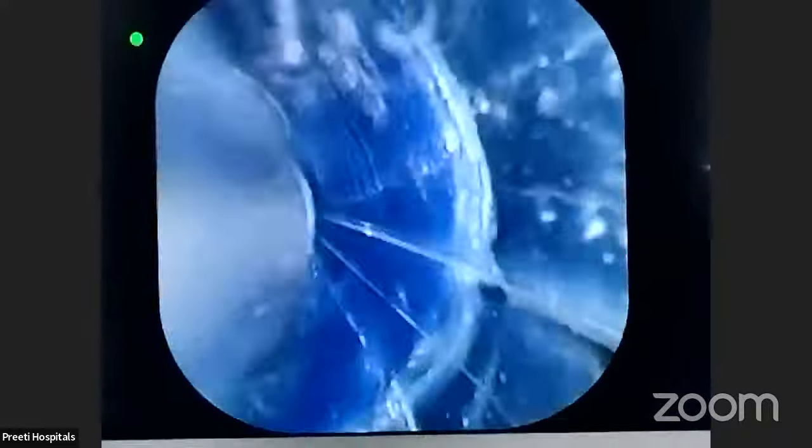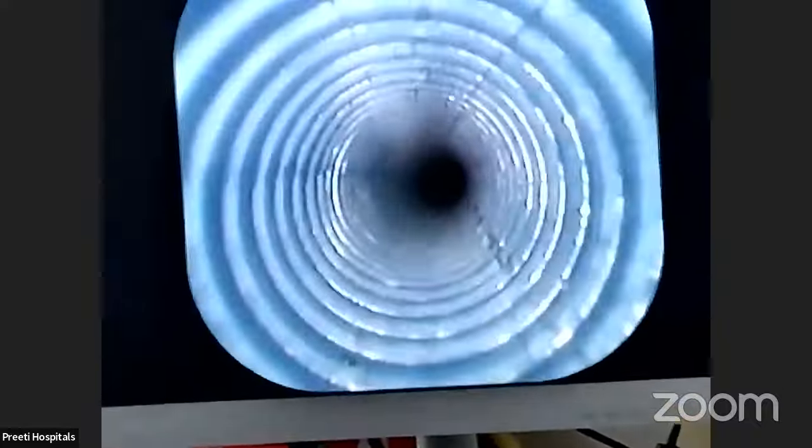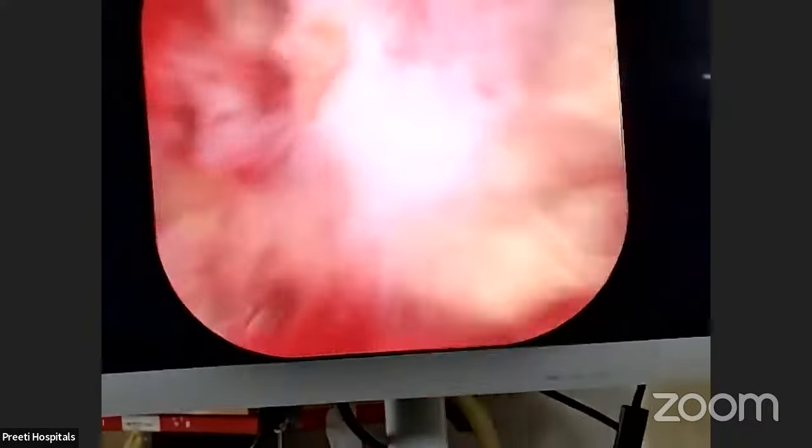See now how they are sucking out. See, the entire thing will get emptied in 5 minutes. How can we say that it is not useful? It is useful, provided smaller access sheaths come in the future. With one French, if they reduce the entire access sheath, see, I am at the tip of the calyx. What else do you want? Now I will demonstrate at the end how we can suck all the calyces if any dust is there. First, let me empty this calyx first.